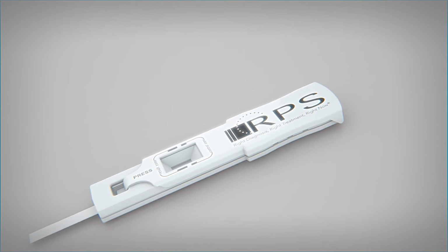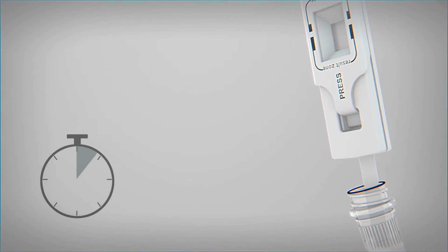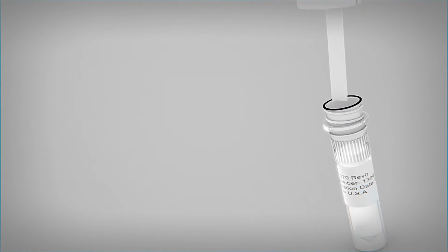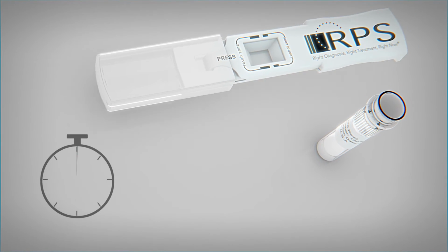Step 3 is running the test. Immerse the absorbent tip into the buffer vial for a minimum of 20 seconds, or until a purple fluid wave is observed moving across the result window. Remove the absorbent tip from the buffer vial, replace the protective cap, and lay the test flat on a horizontal surface for 10 minutes.